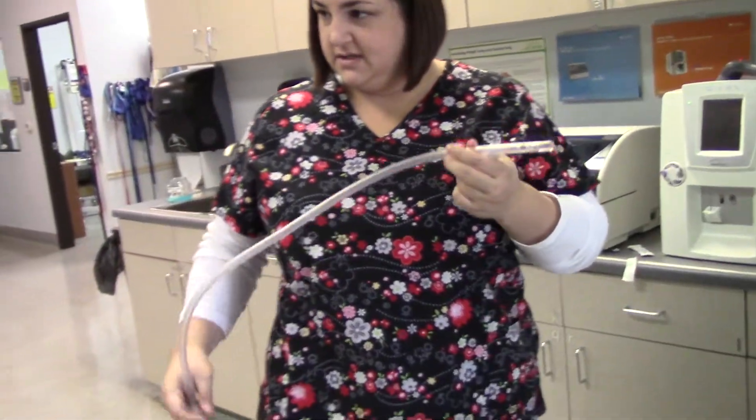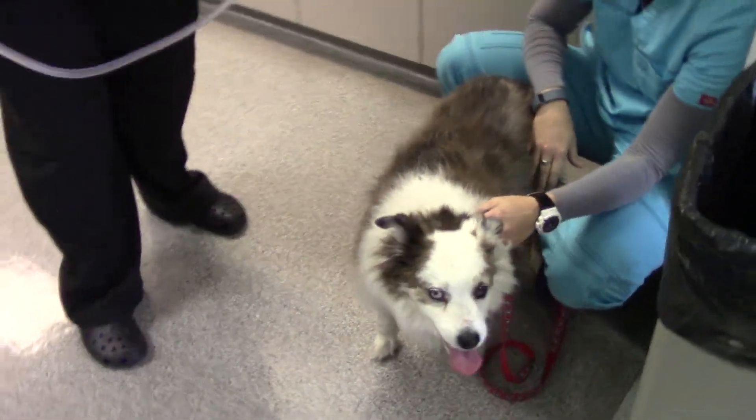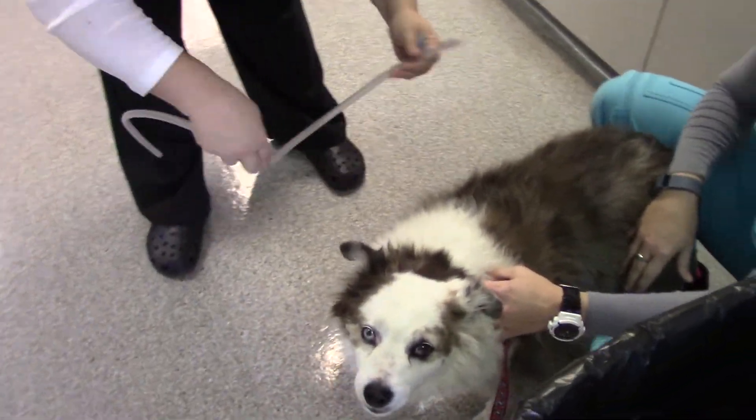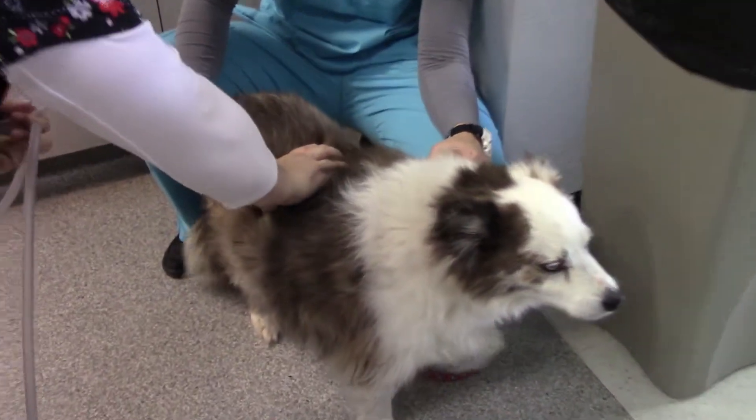All right, so orogastric tube. First you want to pre-measure. Do you guys remember how to pre-measure? Last rib to the nose. Last rib to the nose — I can find your last rib. It's about there.